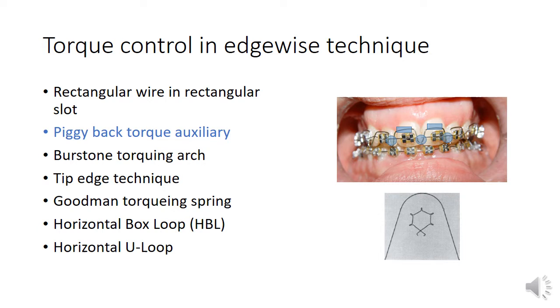As it is partially straightened out to normal arch and hooked on the sides somewhere between premolars and molars to the main arch wire. As you can see, this torquing spring has 5 arms which is placed under the main arch wire, and it has 4 connecting sides that run between the arms, and they push the teeth toward the lingual side.